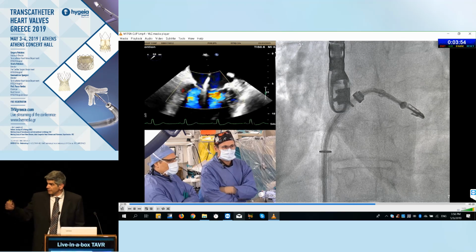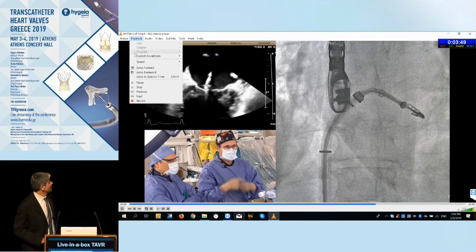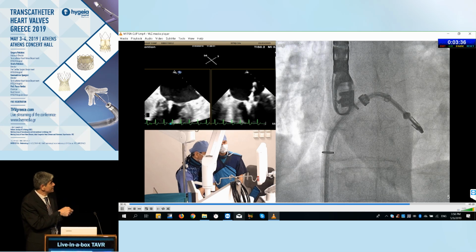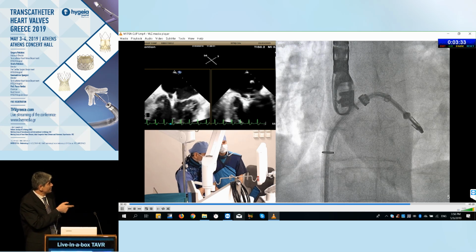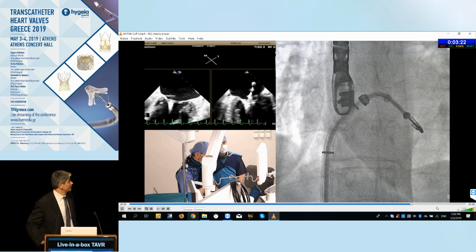We can go to the next. And this is where we were evaluating the degree of leaflet insertion. The best measure for evaluating that is to actually have a good documentation of the grasping sequence, and that's what we had here, very clear, crisp images showing the whole posterior leaflet, anterior leaflet, all the way in, and that was reassuring to us that we were going to have a fine result from leaflet capture.